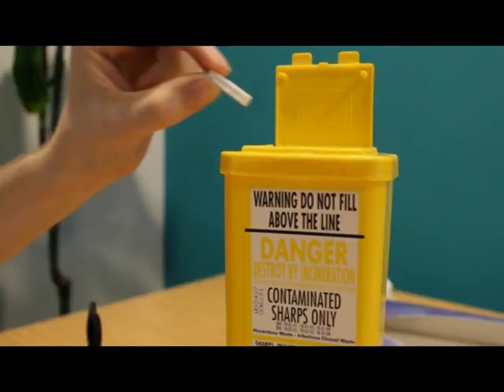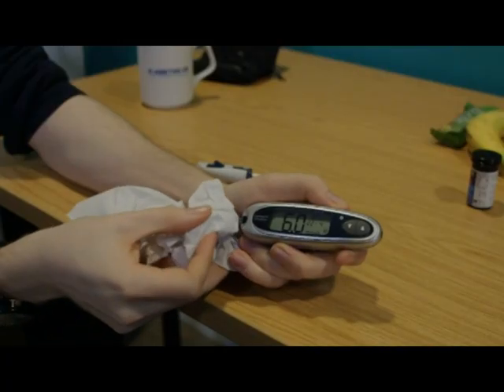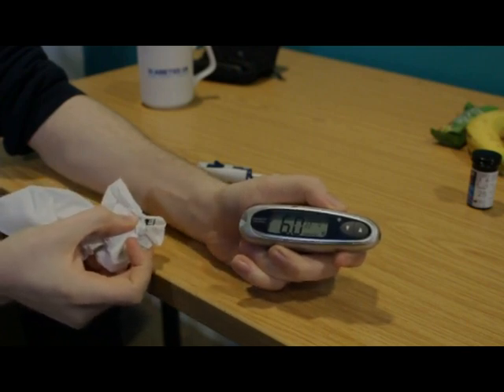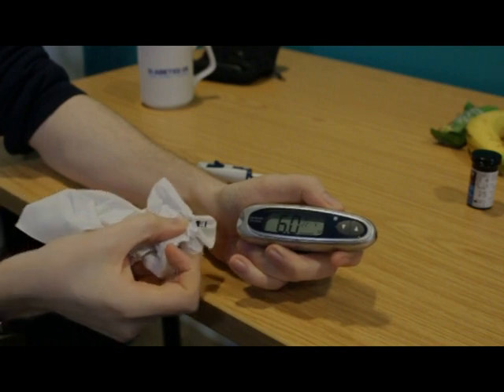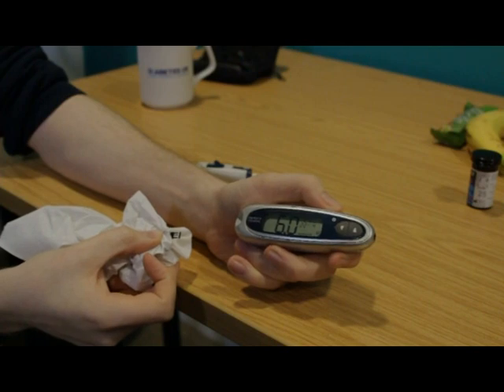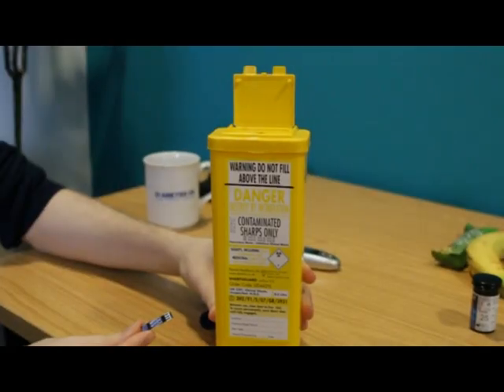Lancets should only be used once. Once the blood glucose reading on the meter is complete, use the tissue to grasp the test strip and pull it out of the meter — this usually turns the meter off. Dispose of the test strip safely, such as in a sharps bin.